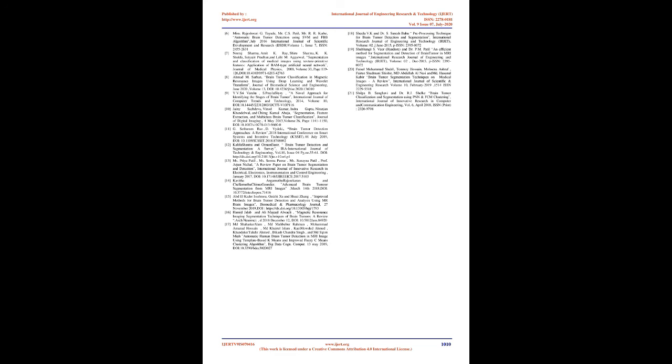Some proposed a methodology which included extraction of texture features with wavelet transform and SVM with an accuracy of 83%. The textural features are extracted from the gray-level co-occurrence matrix, GLCM, and statistical textural features are extracted from LL and HL subbands of wavelet decomposition and 95% accuracy was observed.